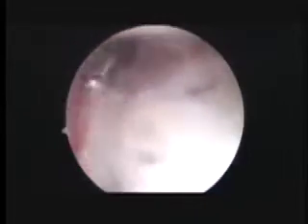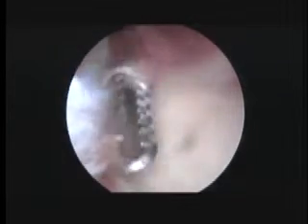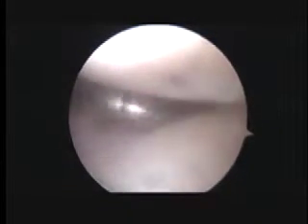So now we're going to look down at the biceps anchor. So far it looks okay. Look right here. No, just show me the biceps anchor. I think that's going to be all right. A little bit of wear and tear changes, but nothing that's a real detachment. As we look down the front of the shoulder here, that looks pretty good. And as we look down the back, that actually looks pretty good also.